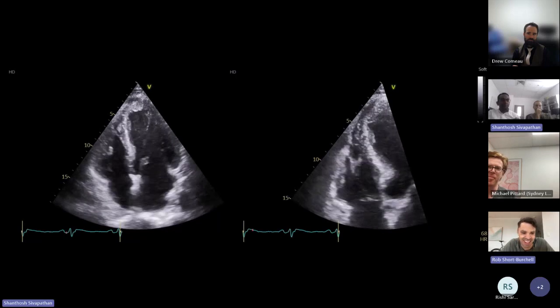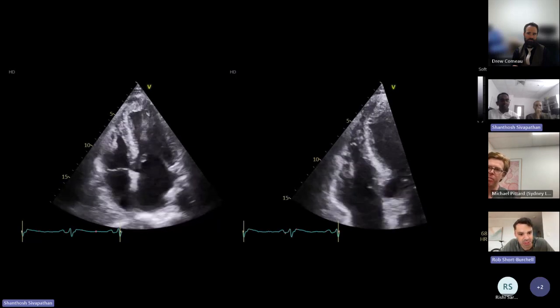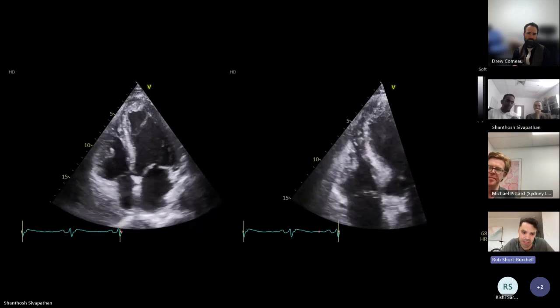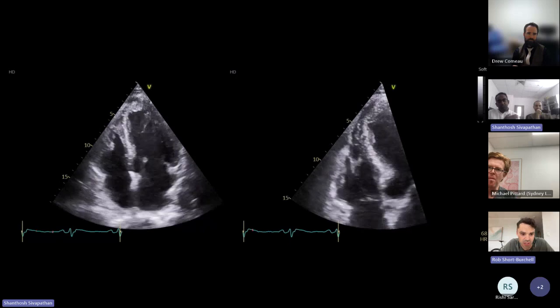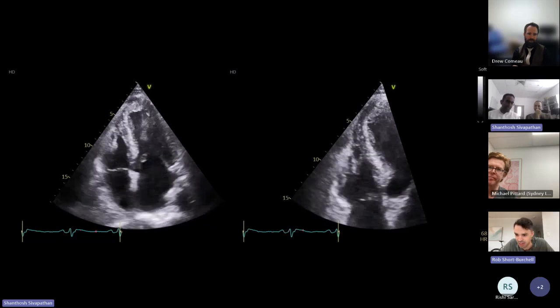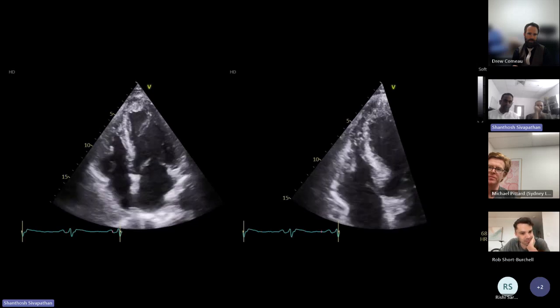True. Sorry. How else could you do it? Color. You could use color flow Doppler. You could. But yeah, the gold standard would be to use contrast. You're 100% correct, Rob, and you've said all the right answers.